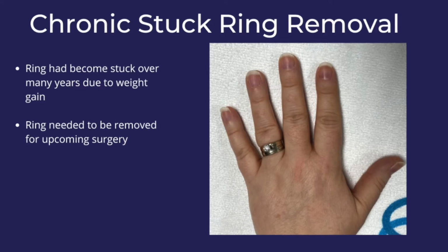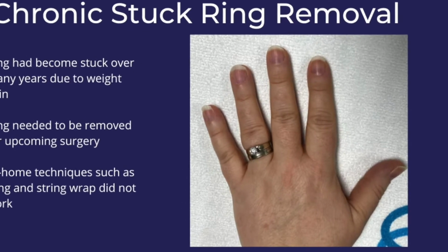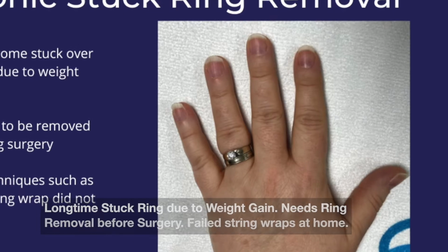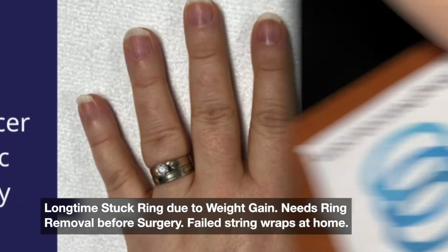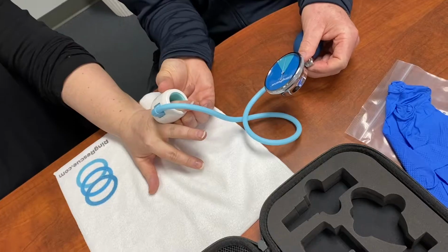Many folks out there have long-time stuck rings, not necessarily causing trouble day to day, and it's stuck due to weight gain over the years. Along comes a need for ring removal, such as before a scheduled surgery. Here's my approach to the problem.